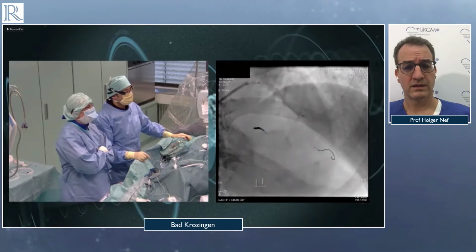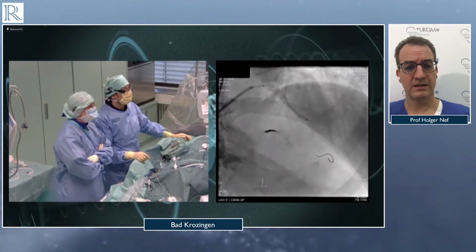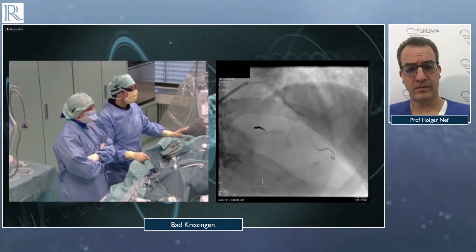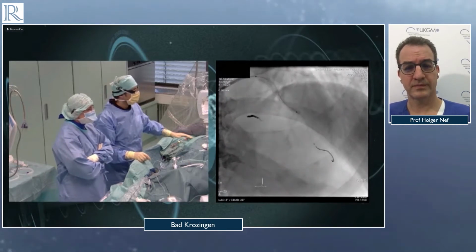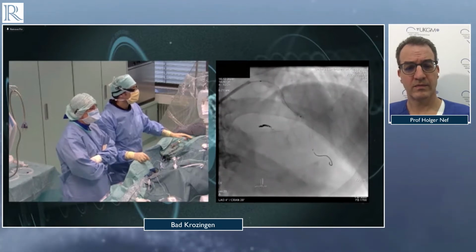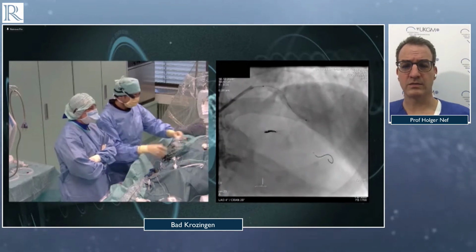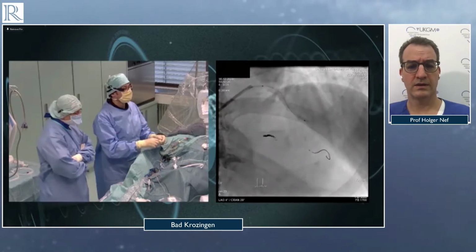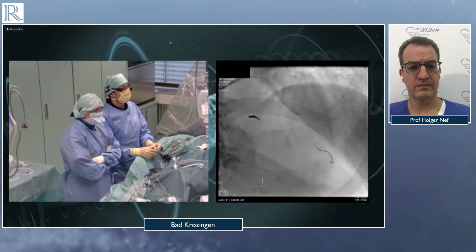Well, it's a very calcified lesion. We were not sure if we could have a good plaque modification in case we use a 1.75 burr. So we just said, and from the last time I also had 7 French, it's a very big artery, and we have maximal backup support. It's a big male, so I think it's okay to go for 7. Okay, that's a good one. To have more comfort. Definitely, as you point out regarding the use of IVL, 6 French would also be suitable.